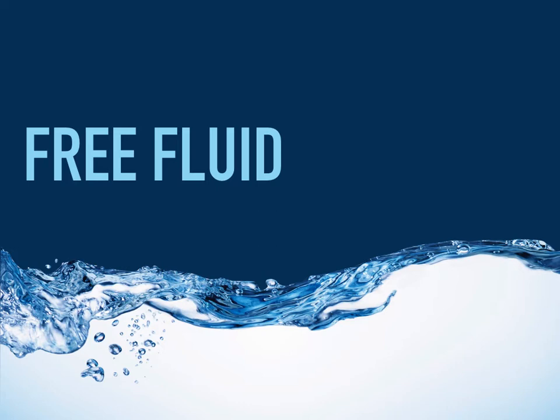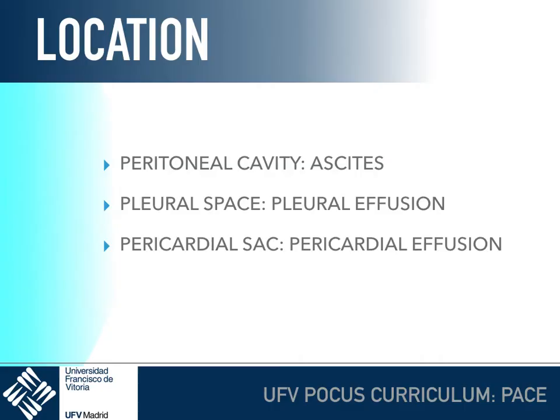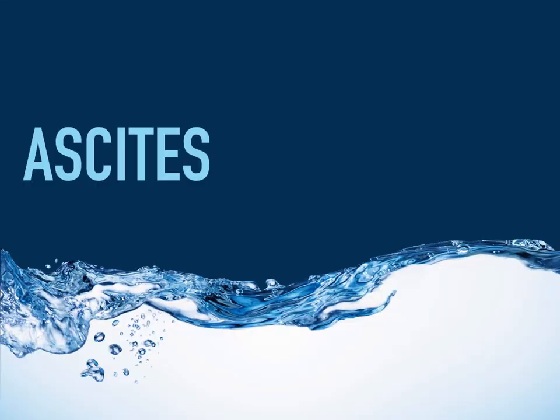If there's something that ultrasound can super easily evaluate, it is free fluid. And free fluid can be located in 3 different places: in the peritoneal cavity, which is called ascites, in the pleural space, which is called pleural effusion, and inside the pericardial sac, which is called pericardial effusion. So let's go to the ascites.